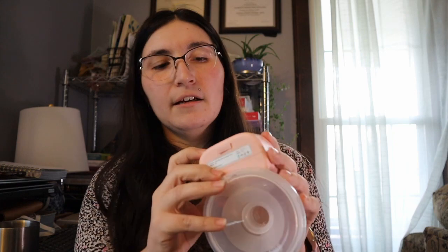On these generic ones here, that is the heart button, I believe. Let's see. So this is normal. I don't know if you can hear it. Yeah, that's normal, that little droplet one here. But this one here is the massage mode. So you can hear it. Those are very short little suction pulses there.